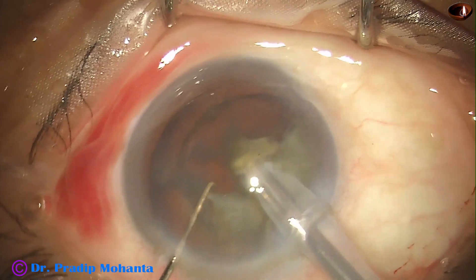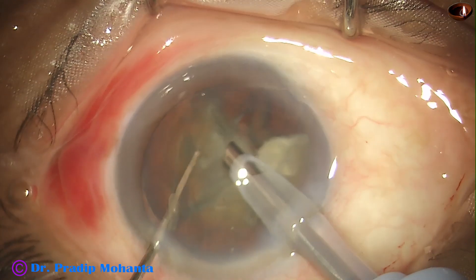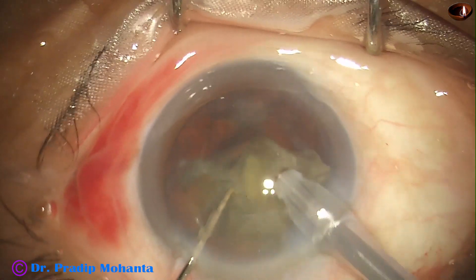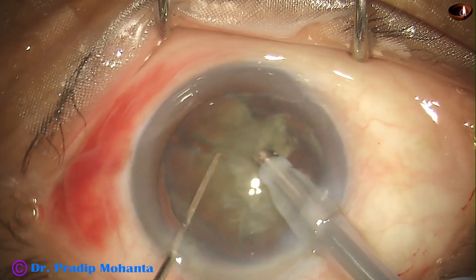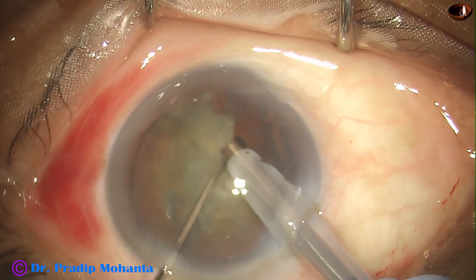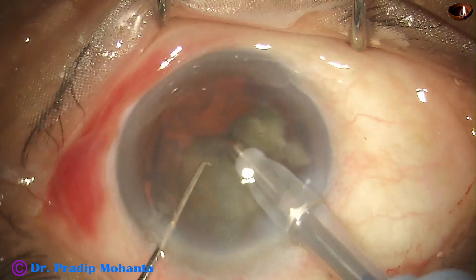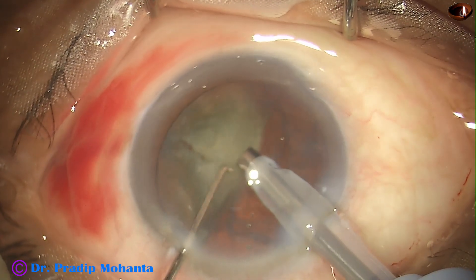Chopping has been done in continuous mode, and emulsification of the pieces is being done in O-pulse mode. O-pulse is occlusion pulse mode. In O-pulse mode, as soon as the tip gets occluded, the mode changes itself to pulse mode, and followability of the pieces increases. Ultrasonic delivery is less in O-pulse mode.